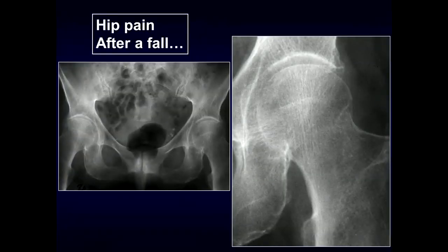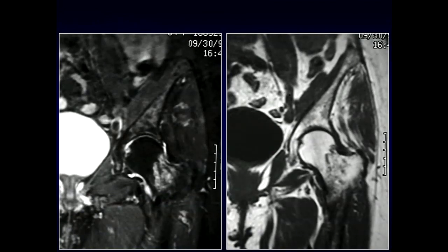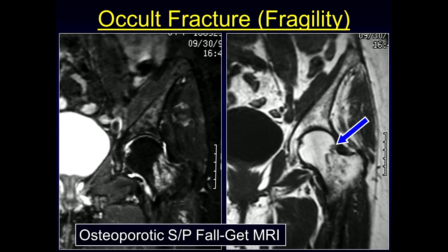A patient came into the emergency department with hip pain after a fall — oftentimes these patients are osteoporotic. Taking a close look at the femoral head-neck junction, there was some irregularity: could it be a fracture or just an osteophyte? The patient underwent MRI, which revealed an occult fragility fracture — they can be radiographically occult. The key is that patients coming in following a fall who are osteoporotic should proceed to MRI for further evaluation.